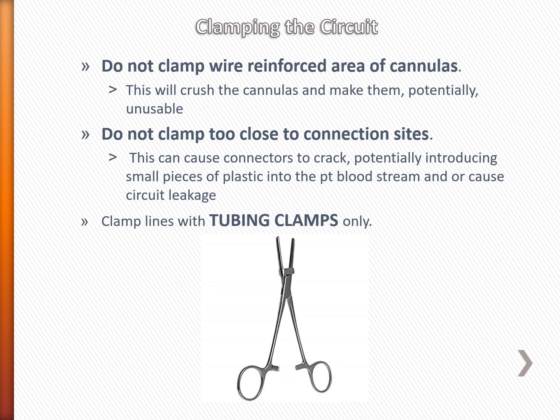If you don't know what the difference between a regular clamp and a tubing clamp looks like, please feel free to ask any of the perfusionists or any of your more experienced co-workers. So just for your own safety, please, again, make sure there are no scissors and no sharp clamps hanging on the ECMO pump at any time.